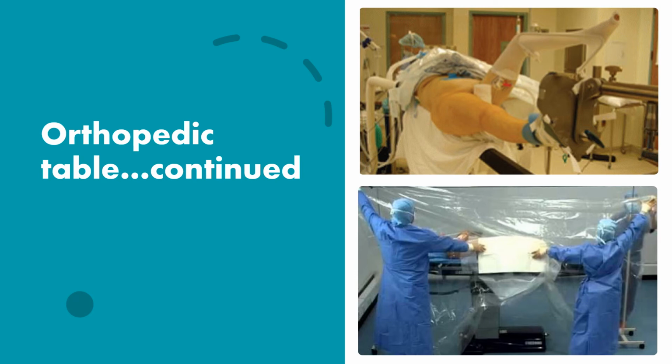And you can't see it, but there's an IV pole here. I'm just going to draw that. And there's an IV pole here. And the IV pole has these little loops. I can't draw with this mouse. But then we put another rod going across this way. And that shower curtain drape is going to go up over the rod. It has a little adhesive strip, and it's going to get stuck to itself on the other side.